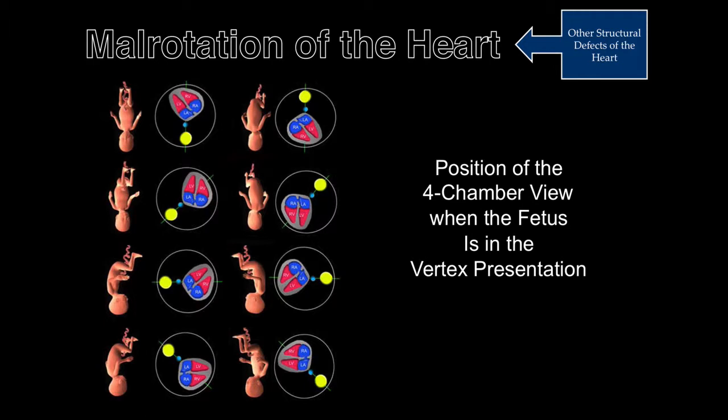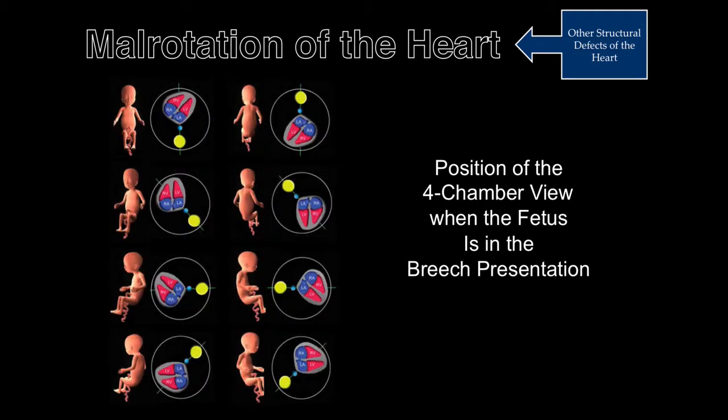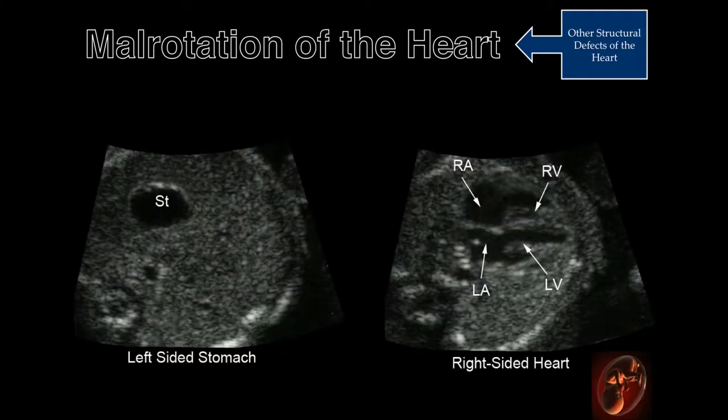This illustrates the position of the four-chamber view when the fetus is in the vertex presentation. This illustrates the position of the four-chamber view when the fetus is in the breech presentation. This demonstrates a case of dextrocardia, with the stomach on the left and the heart rotated to the right.